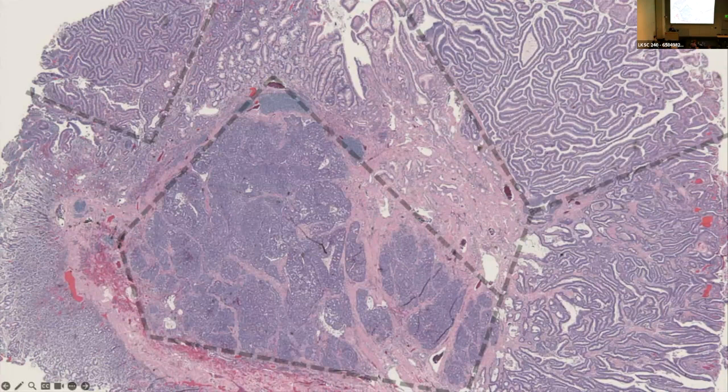What I like to do is start with the clinical clones that people have validated for decades. There's a site called NordiQC where they have all the clinical clones that people have used, and they've formally validated them in a clinical lab. So I usually like to start there. And yeah, I hope that answers that question.